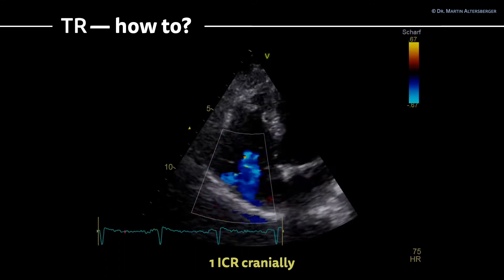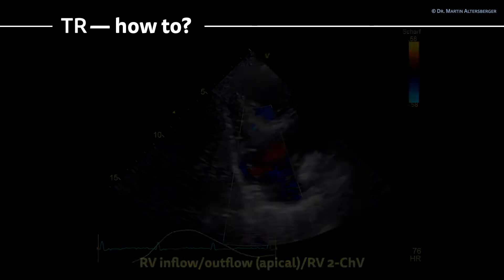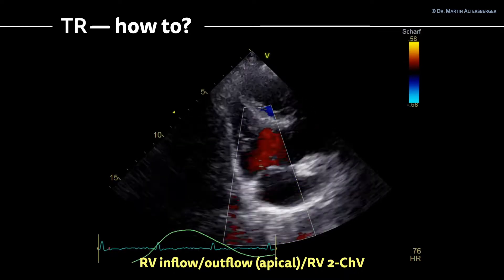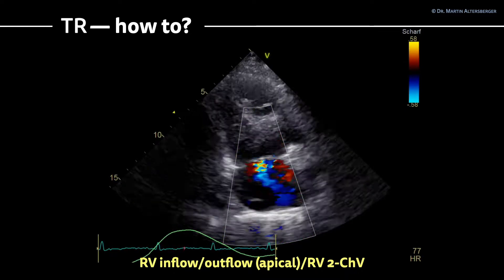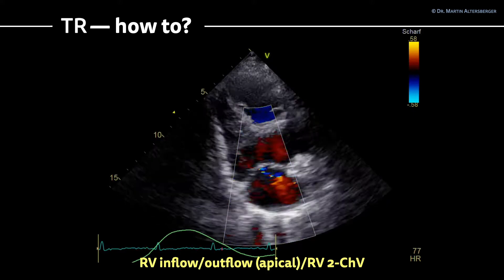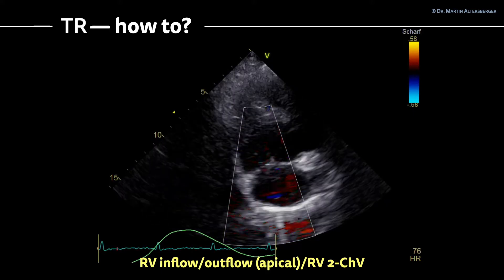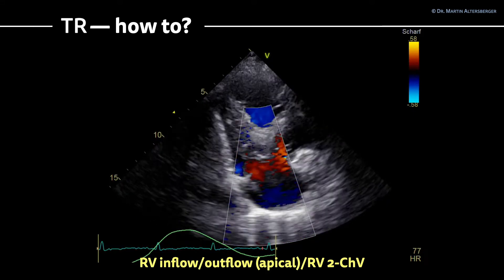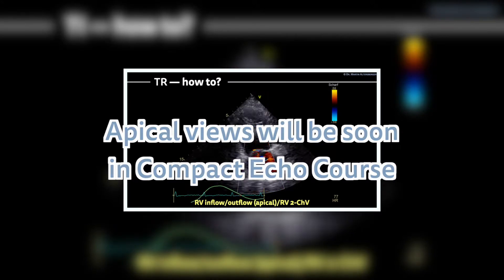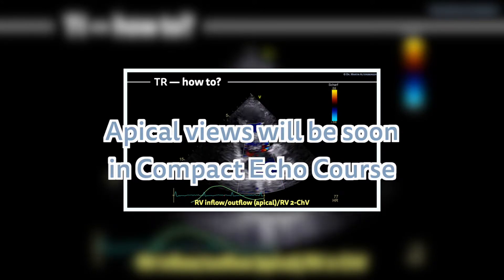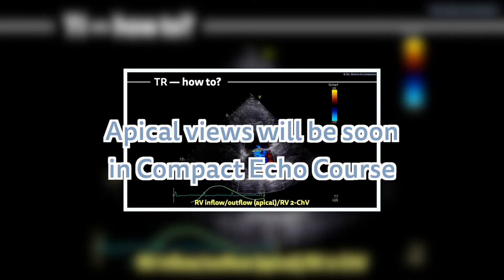If that is also not possible, you can go to a right ventricular inflow-outflow view — that is an apical view, or an apical two-chamber view of the right ventricle. How to acquire these views you will learn in the Compact Echo course, so check it out as soon as it is online.